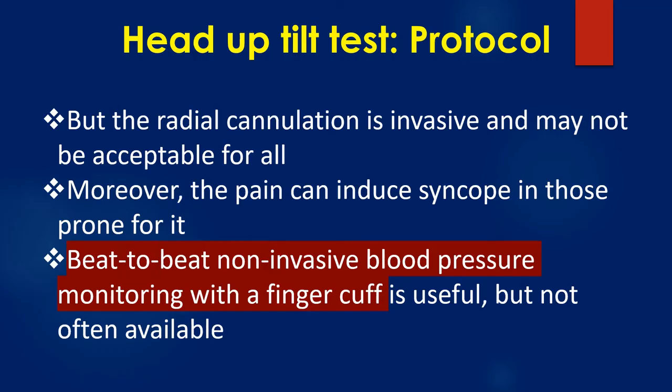But the radial cannulation is invasive and may not be acceptable for all. Moreover, the pain can induce syncope in those prone for it. Beat-to-beat non-invasive blood pressure monitoring with finger cuff is useful but often not available.